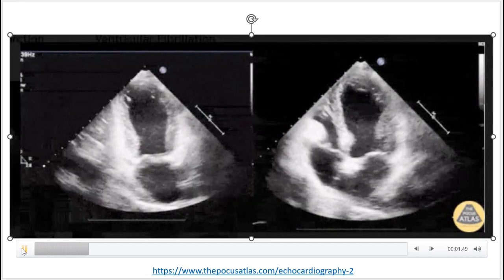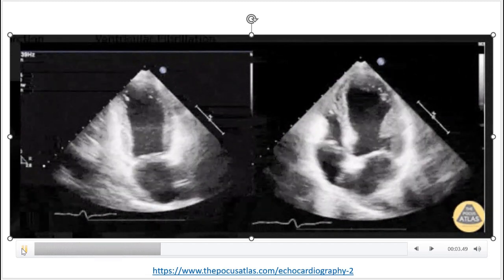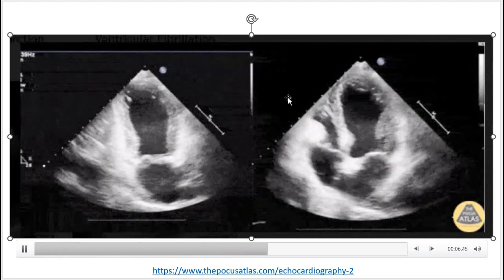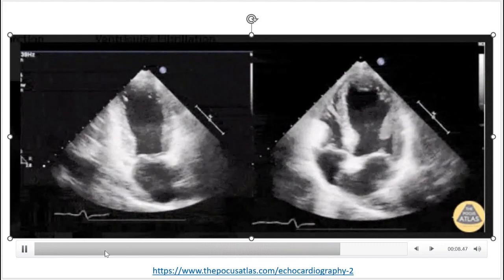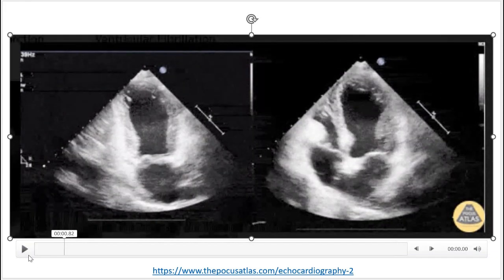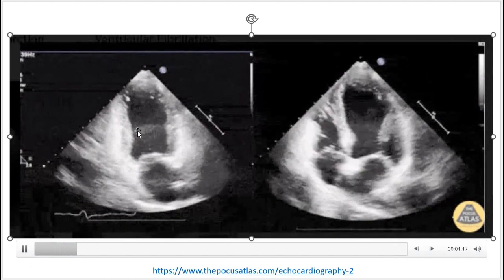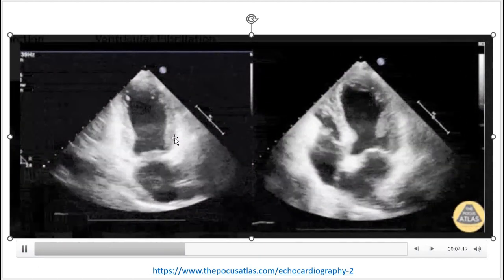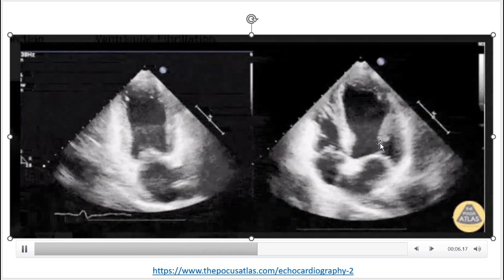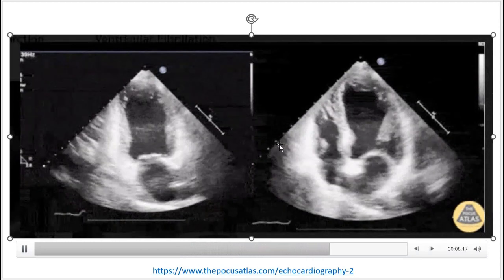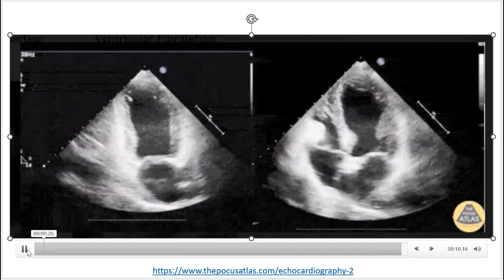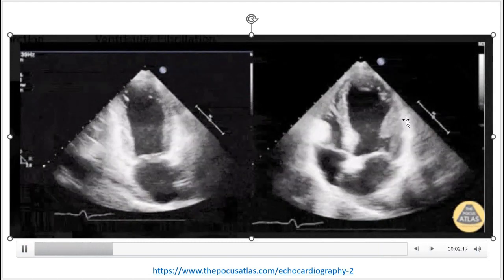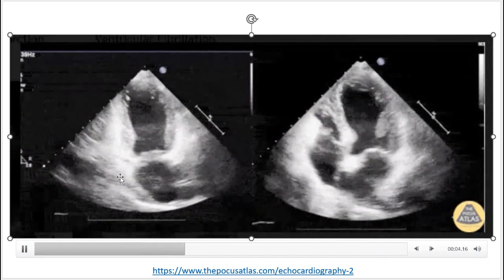Here are examples of stress cardiomyopathy. Here you can see a two-chamber view on the left and a four-chamber view on the right. You can see that there's apical ballooning — the basal and mid-segments are moving towards each other as the heart contracts, whereas the apical areas are not contracting as they should be.